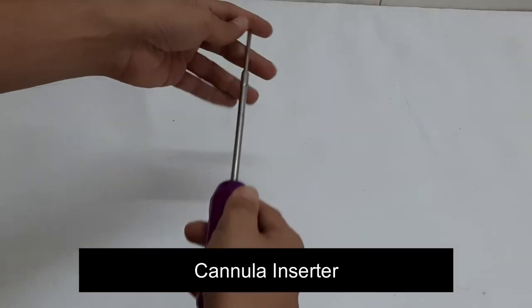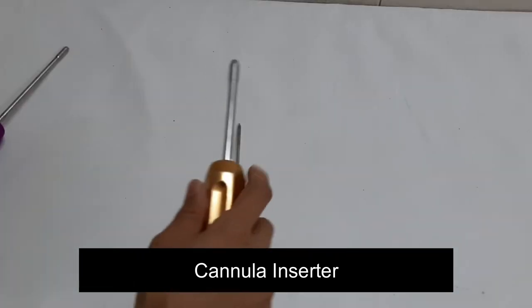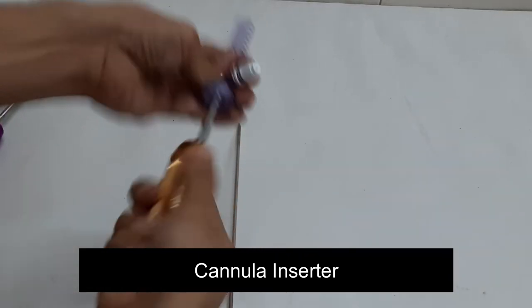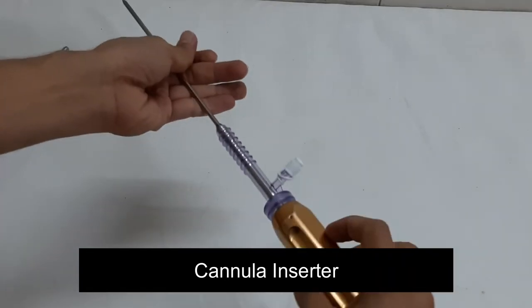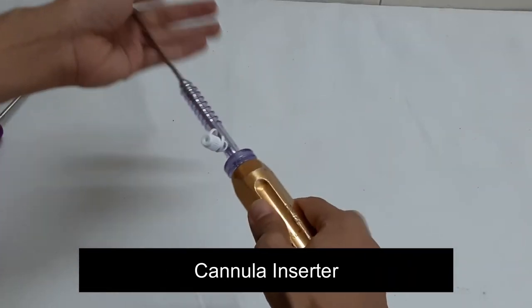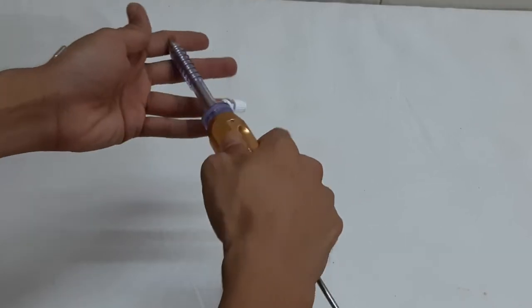This is the cannula inserter. It is used to dilate the portal and comes in various sizes. It fits into the slot of the cannula and is rotated clockwise to push the cannula inside the portal.